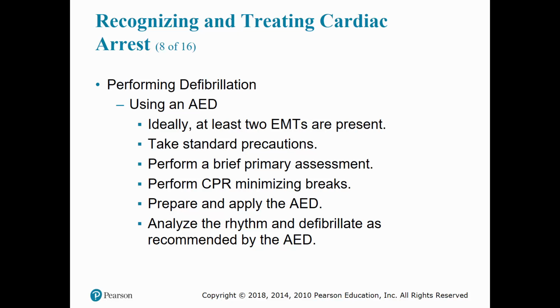If no one witnessed the cardiac arrest, immediately begin CPR and then apply the AED as soon as it is available while chest compressions are being performed. Perform AED operations from the patient's side to minimize any interruptions in chest compressions.